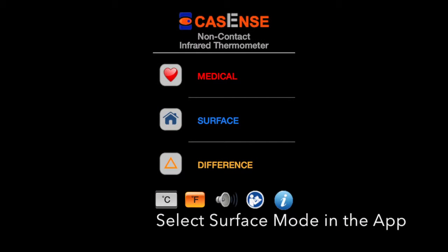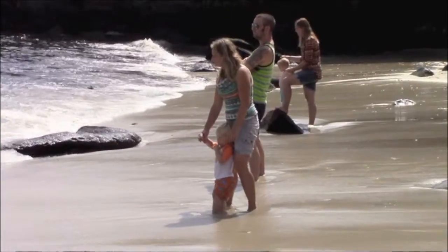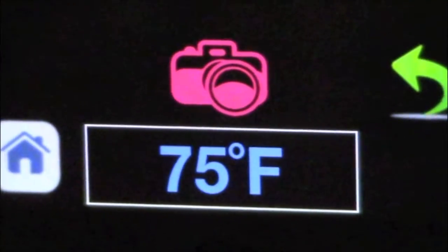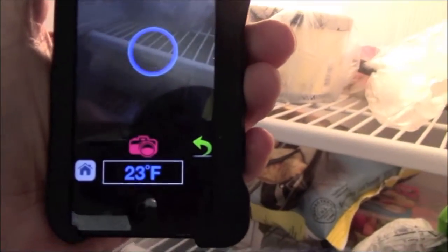By selecting the surface mode, we can measure temperature of any object. There are thousands of uses for a non-contact thermometer in your smartphone.